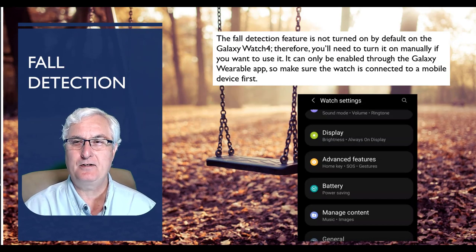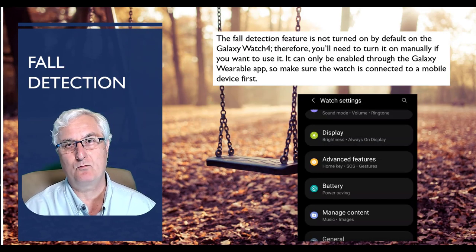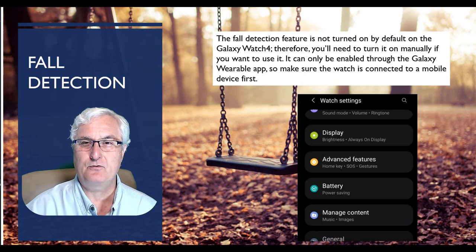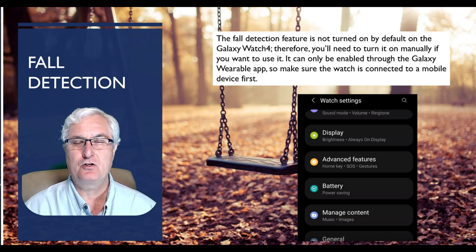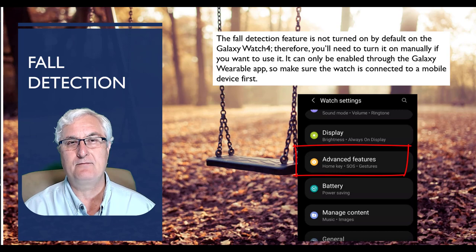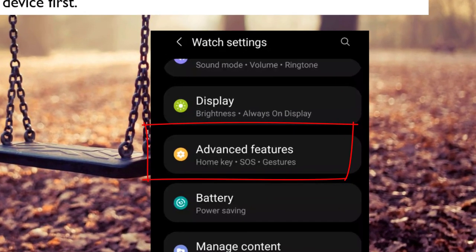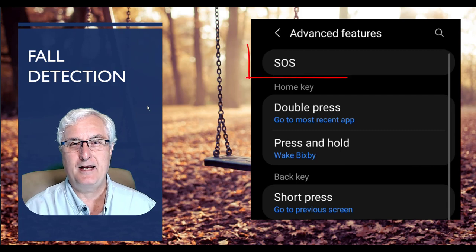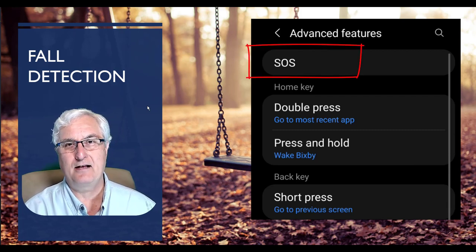The fall detection feature is not turned on by default on the Galaxy Watch 4, so you'll need to turn it on manually. It can only be enabled through the Galaxy Wearable app, so make sure the watch is connected to the mobile device first. In the app, go to Advanced Features and click on it. You'll see it says Home Key SOS Gestures — click on that, and the next menu will show SOS at the top. Click that.